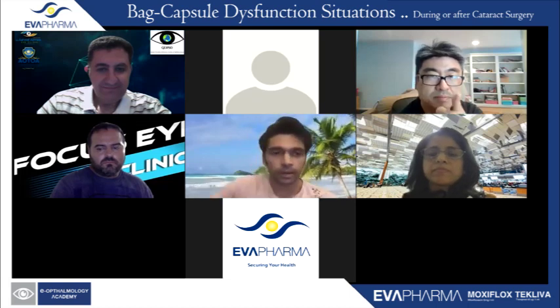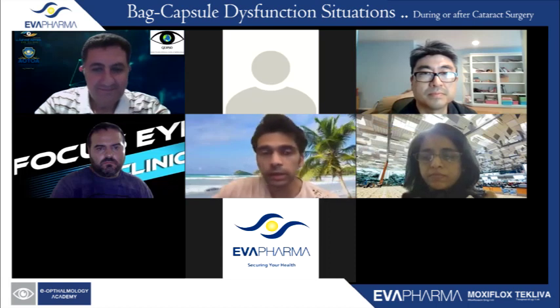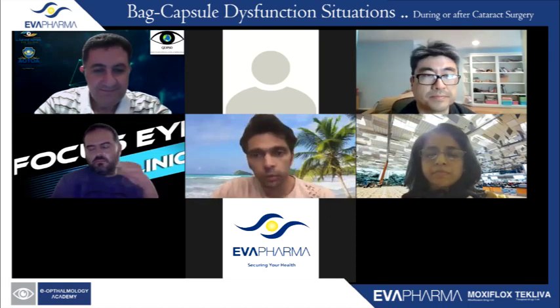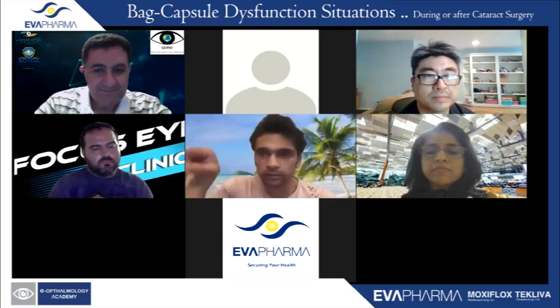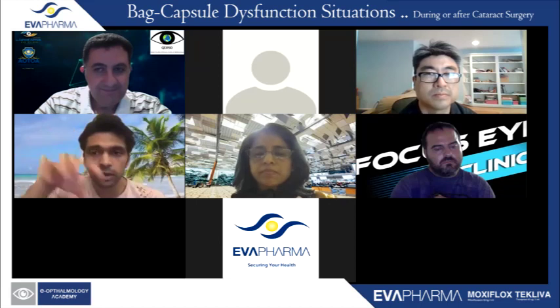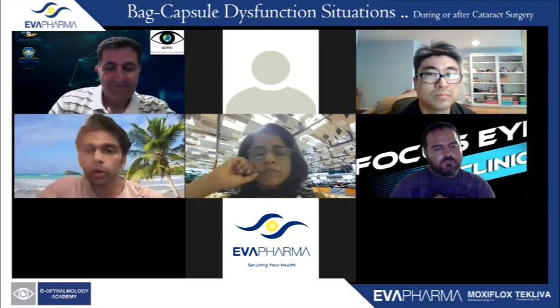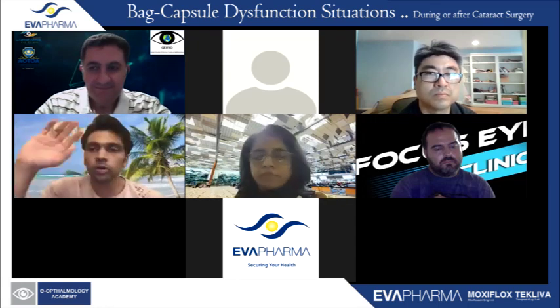Yeah, I completely agree. One added point I'll add to that, Brian, and I would do this now, I didn't know this at that point of time: if you do have an anterior capsular rhexis, please leave that, because that way you can avoid doing the pupilloplasty, because then the optic does not pop up.